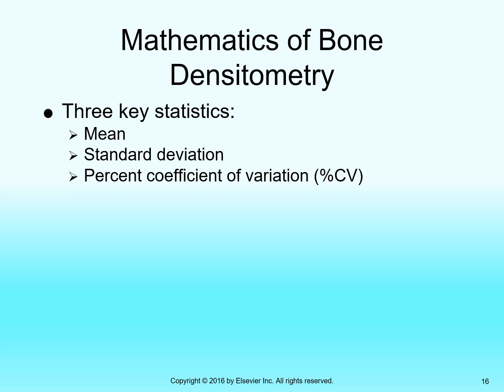It's a comparison of, okay, machine A was made by GE and it measured, I don't even know what the calcium score scale is, let's say 10. But then you went across town for your 6-month follow-up and they used a Philips machine and they scored you at 12.